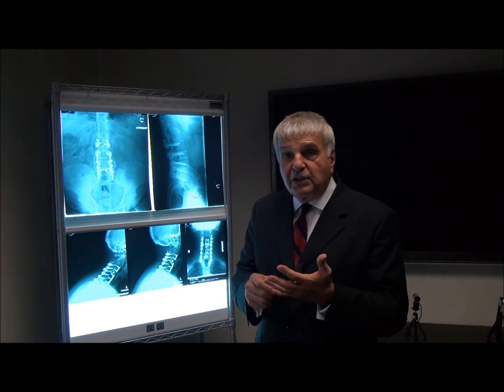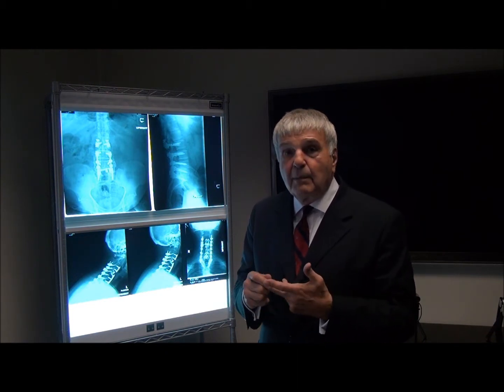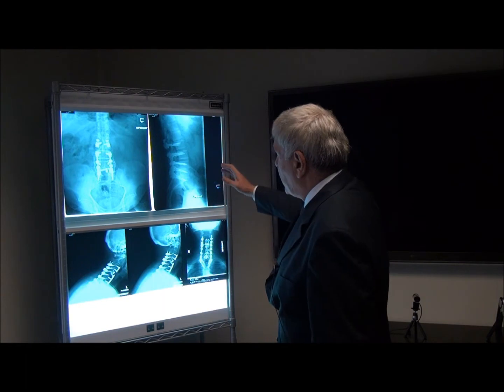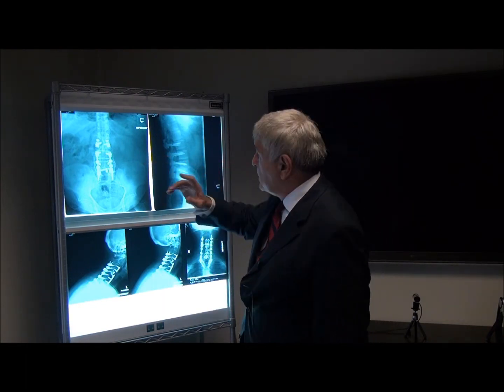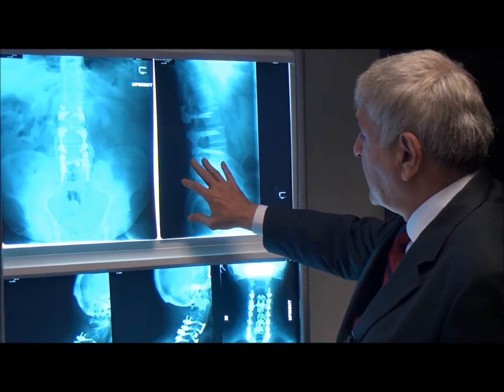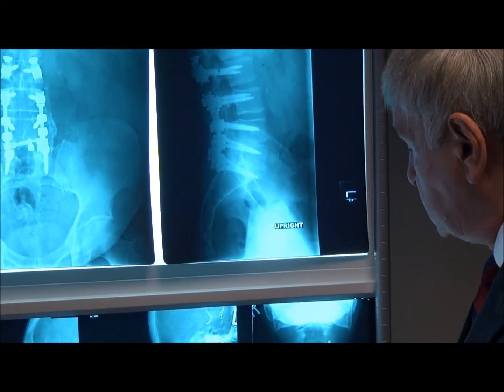I know that the diagnosis was correct. I know that the procedure they chose was correct. But now I've got to look at the procedure itself to see if anything went wrong. And here we have a patient who had major surgery in the lumbar area, which is these two top x-rays, and in the cervical area.